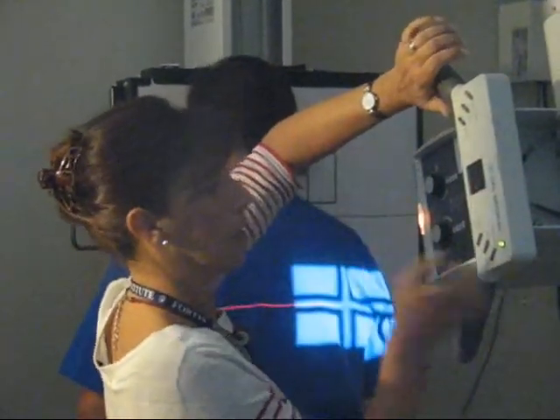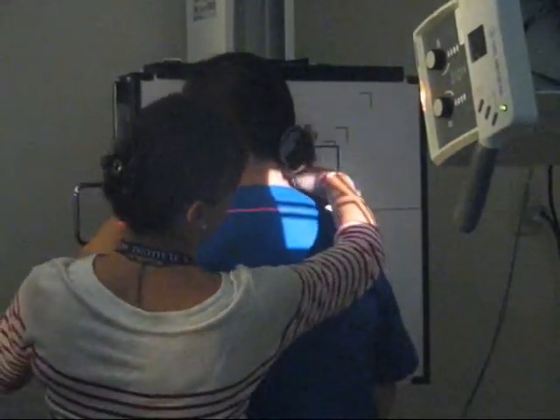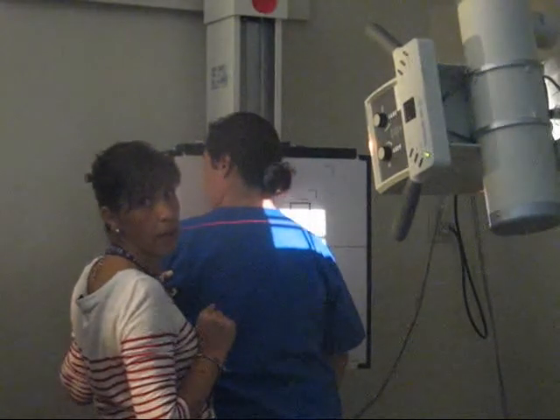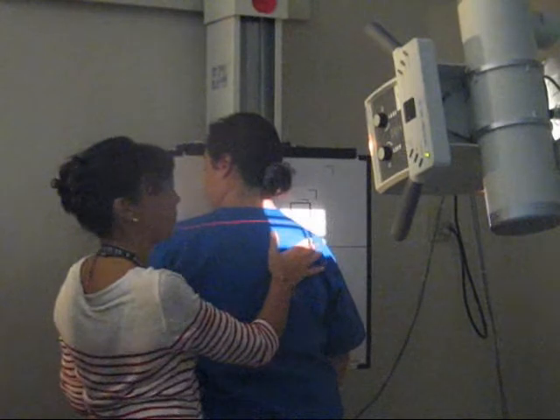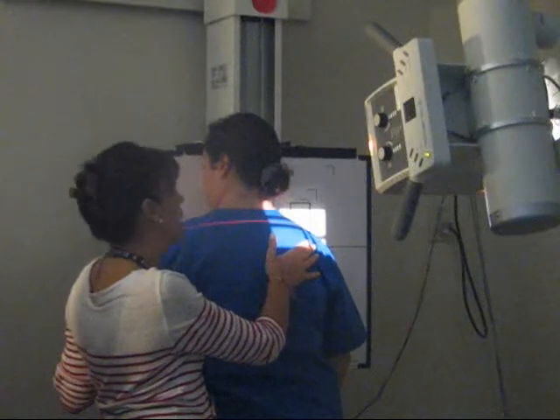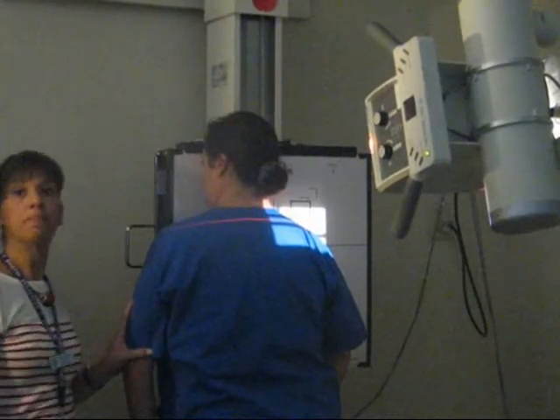Okay, and of course then you will have to adjust. You can imagine that your clavicle is up there, and you're going to have to adjust your film that is not there. Straight. And this way, your clavicle is a little closer to the IR and therefore provides a little more detail. So just remember, if it's a PA projection, you're going to angle 15 degrees caudad. If it's an AP projection, you're going to angle 15 degrees cephalad.